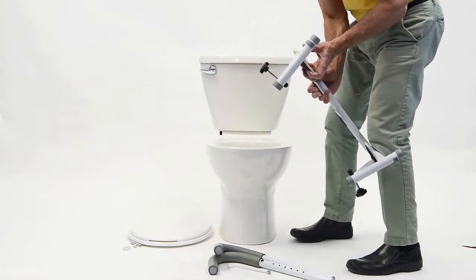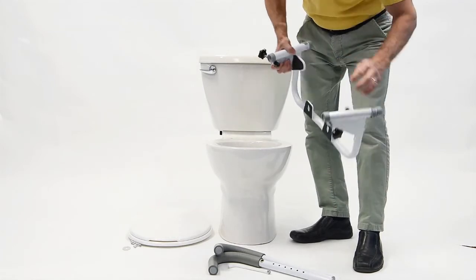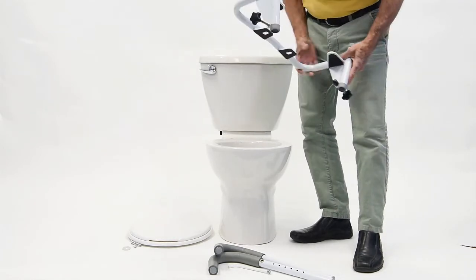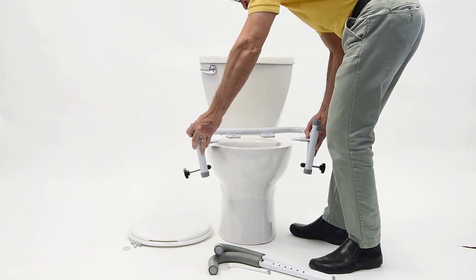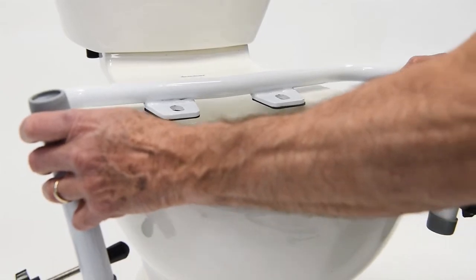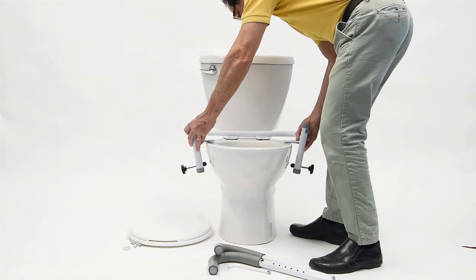Pick up the main section of the Ultra Frame and ensure you back off the adjustable tension knobs completely. Locate the rear of the frame, indicated by the two holes on the base plate where the toilet seat hardware will be reinserted. Slide the frame over the toilet and line up the Ultra Frame holes of the base plate with those of the toilet itself.